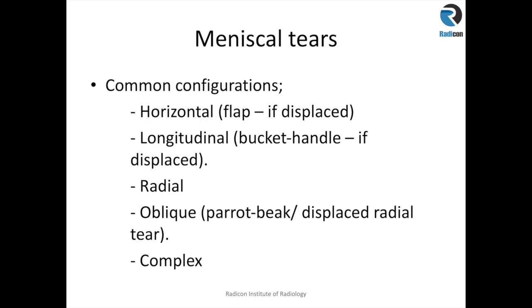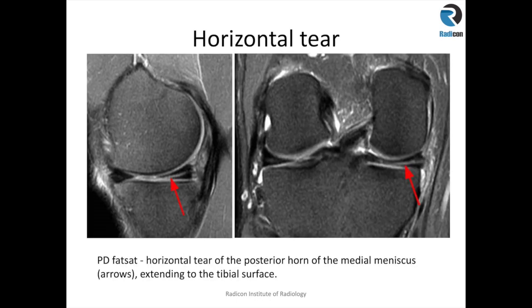This is an example of a horizontal tear where you can see signal change at the posterior horn of the medial meniscus reaching the articular surface, which is inferior or tibial. This is a classic example of a horizontal tear, which is most of the time a degenerative type tear.